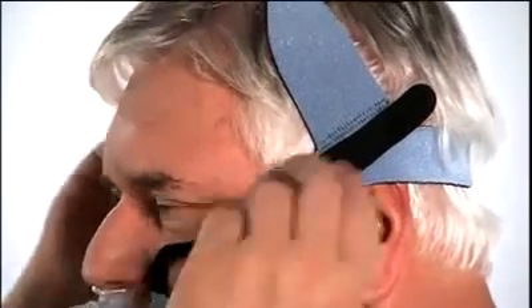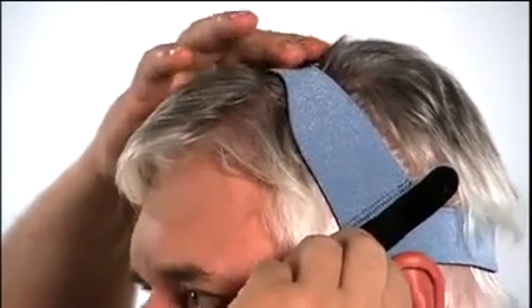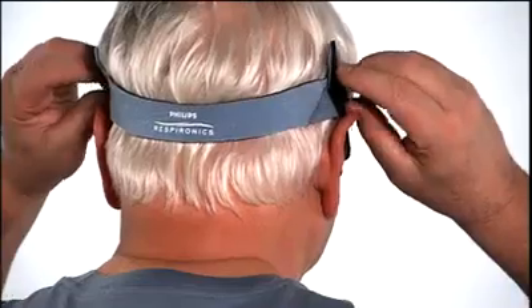If the side straps are on your ears, tighten the top strap slightly. There should be no gap between the top of your ears and the side headgear straps.